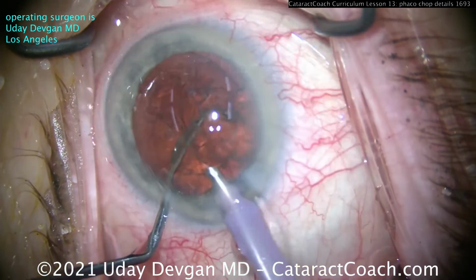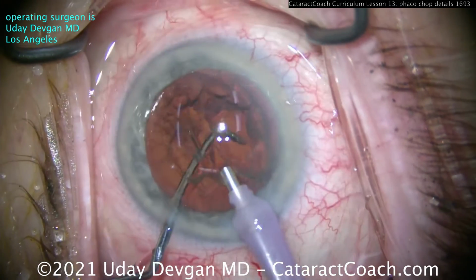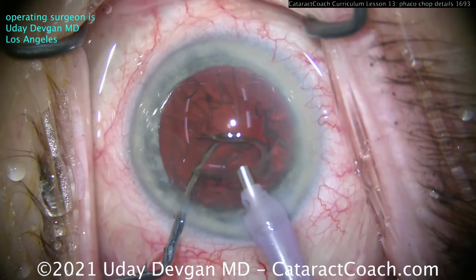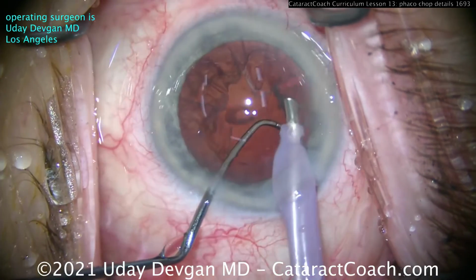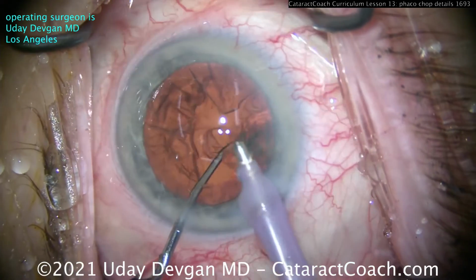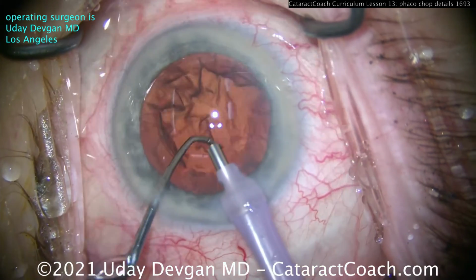Very, very stable technique and very repeatable. This is a nice way to learn chop. So I call it combo chop. It's been described by many other surgeons. This is nothing that I've invented. So we see that's very efficient and very safe. Now let's watch it again.